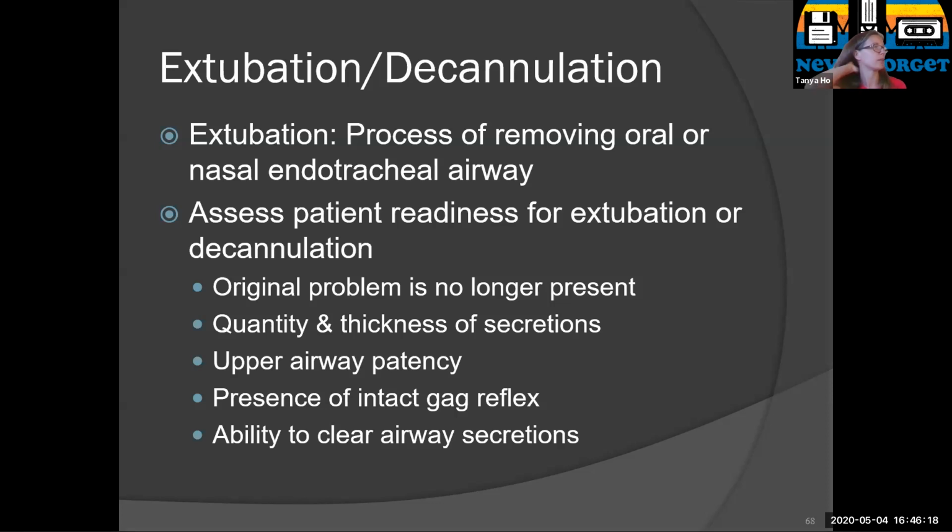So sometimes prior to extubation, we'll go in, orally suction, and go back kind of far to see if they gag, and you're like, oh, sorry, but really you intended to do that to be like, okay, check, they have a gag. You don't want to keep gagging them so that they throw up, but just one time, go back there, apologize. But then in your head, you're like, that's great, because now I have an intact gag, I'm happy. And the ability to clear secretions.